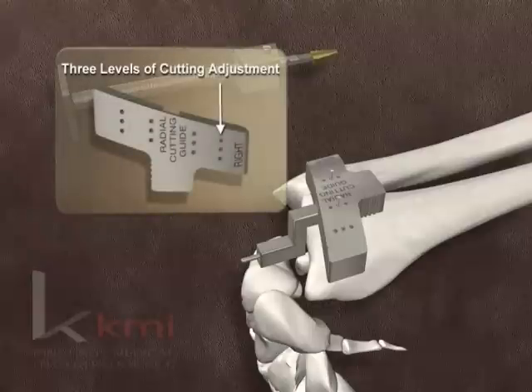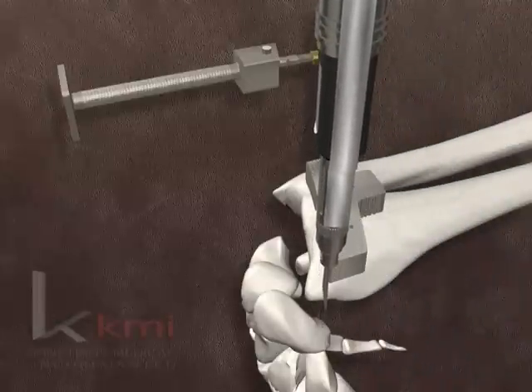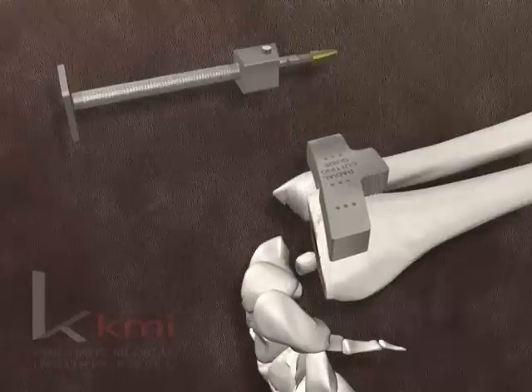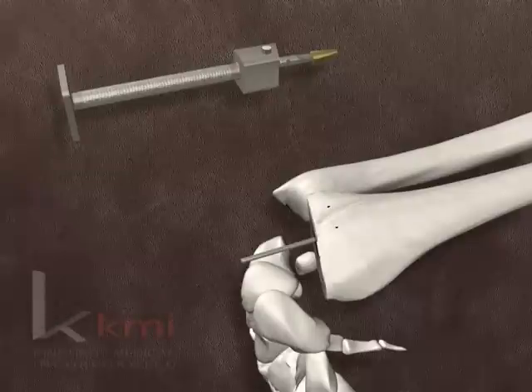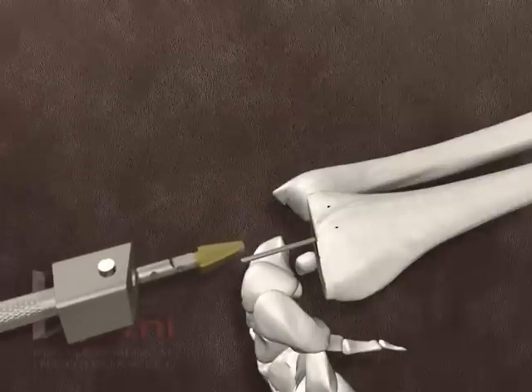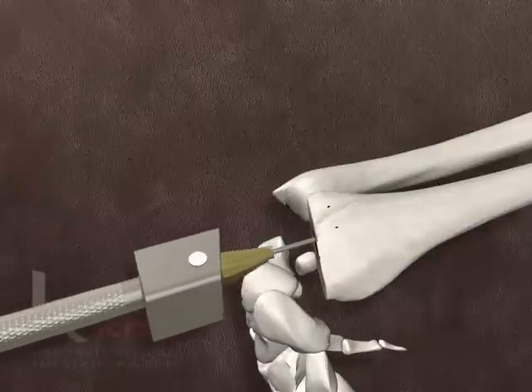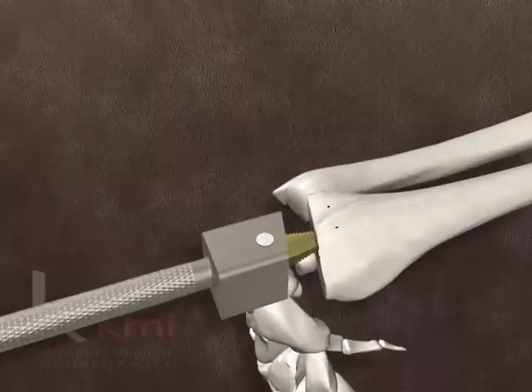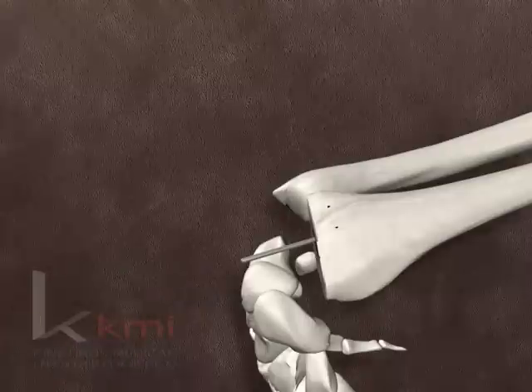The position of the cutting block is checked for proper level of resection and adjusted if needed. The alignment rod and guide bar are removed. A small oscillating saw is used to make the radial osteotomy. To complete the cut through the volar cortex, the cutting block may have to be removed. The cutting block and K-wires are removed. The alignment rod is reinserted into the hole in the radius. The proper size broach head is inserted into the broach handle for either standard or minimal broaching. The broach is slid over the alignment rod, its ulnar face aligned generally parallel to the sigmoid notch of the radius, then driven into the distal radius with a mallet until its collar is flush with the cut surface. The broach and alignment rod are removed.